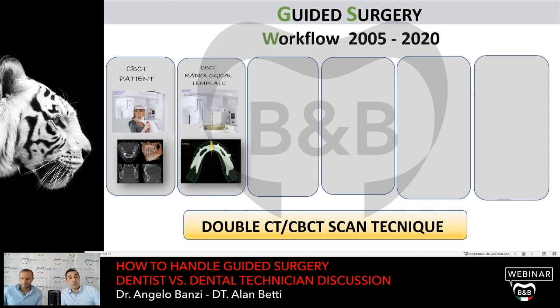Yes, it's very important, especially that this prosthesis fits well with the gingiva, because if the prosthesis moves in the patient's mouth during the CBCT exam, it will be a big problem.